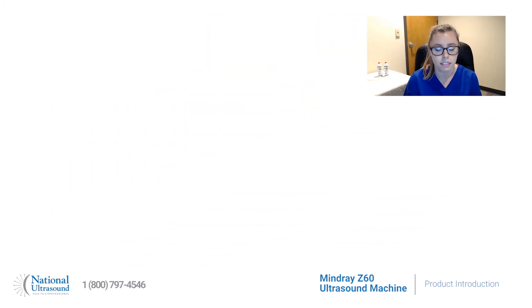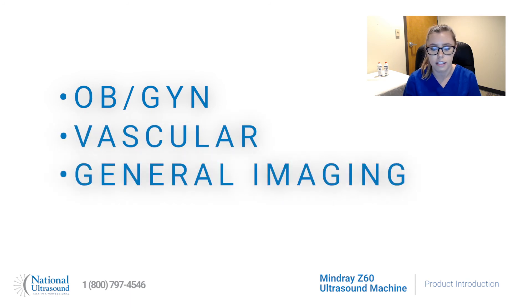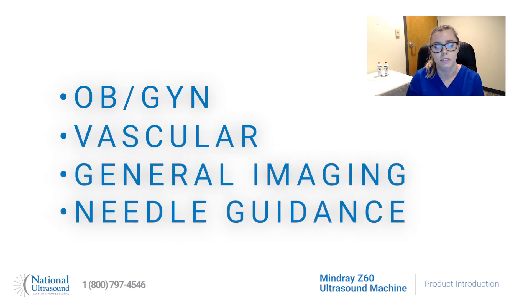Overall, the Mindray Z60 Ultrasound System is a perfect solution for the practice looking to perform consistent OB-GYN, vascular, and general imaging exams and needle guidance procedures. Schedule an online demo today with your National Ultrasound sales rep.